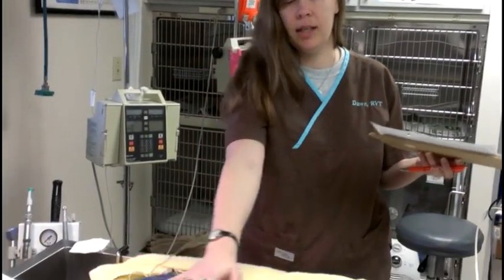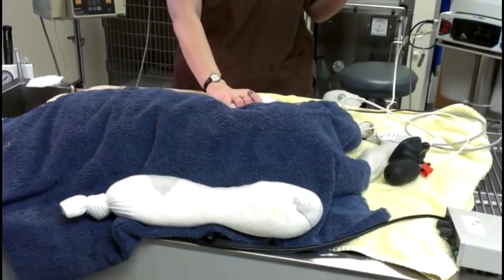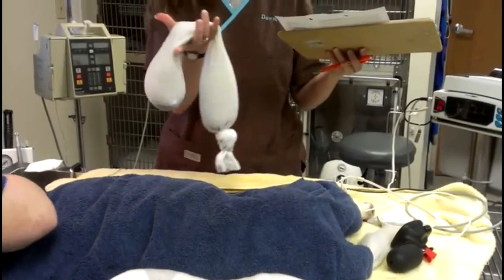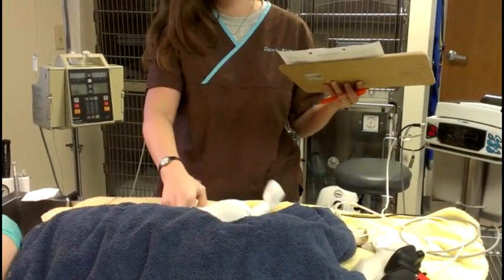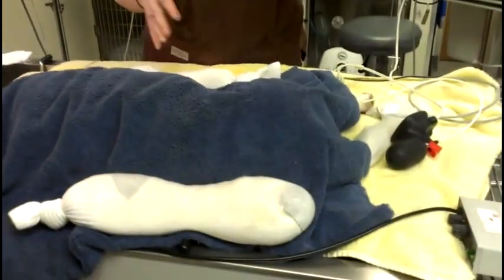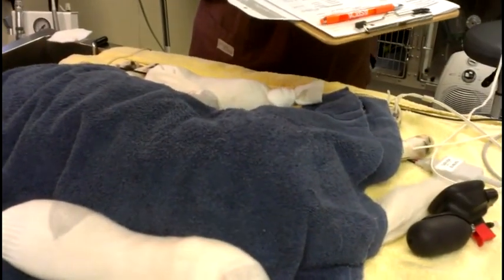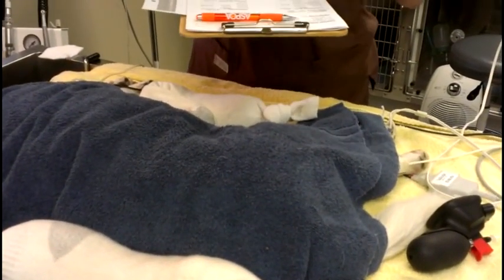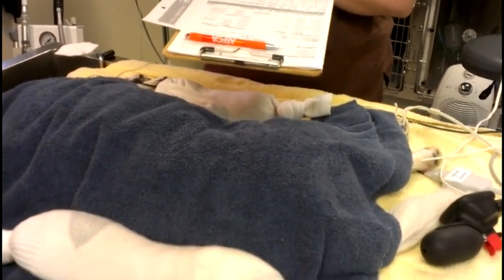One way that we do that is keeping the patient covered with a towel during the procedure. We also use rice socks, which is just a tube sock filled with uncooked rice. We pop those in the microwave for a couple minutes, and they hold heat for a little while. So we'll put those near the patient to help keep the body temperature normal. We'll also take her temperature throughout the procedure. If her body temperature gets a little low, we'll add some other warming factors to keep her body temperature up.